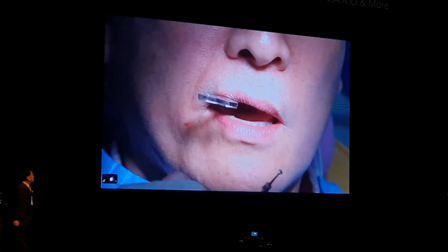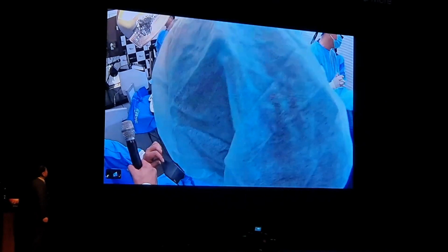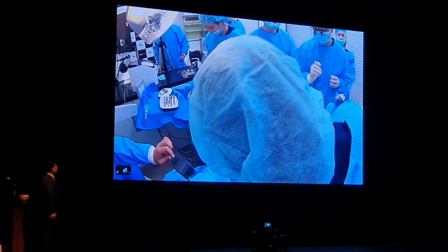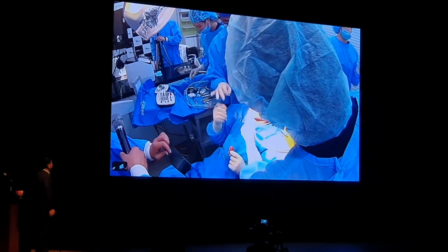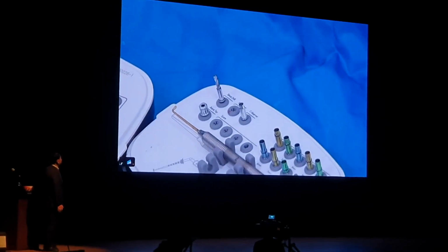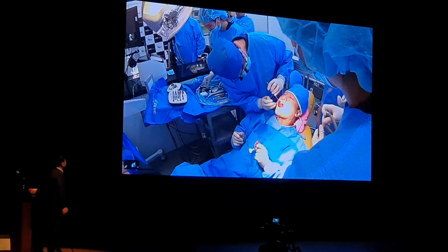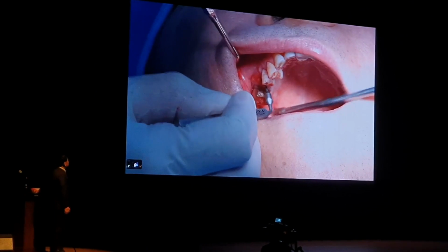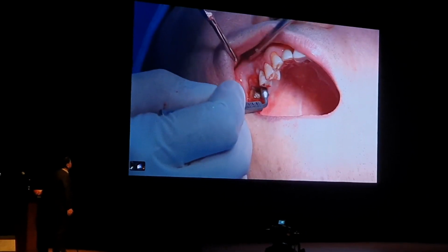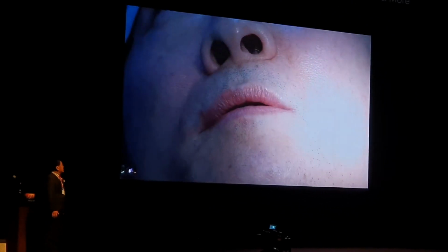Yes, please, Dr. Kim. Oh, he says he'll check with the stopper himself. By himself? Suction? Self-suctioned. Open your mouth. Suction, please. Okay. Yes, it's opened. The sinus is opened.